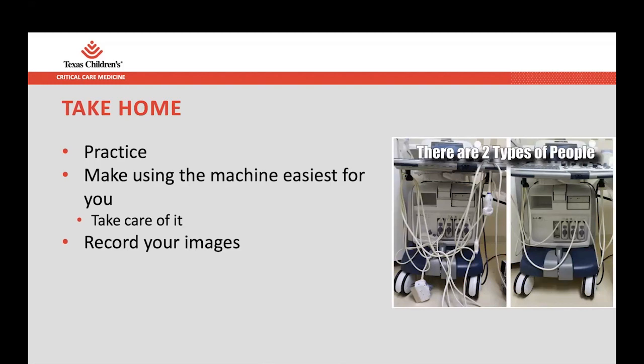And then this whole talk would not have been possible without recording images. And so again, it's just better for everybody. It's better for you. Decisions that you make are well substantiated. Nobody has a full echo done every morning at 7 a.m. And so when we're rounding with the surgeons, we had that available. And then it's better for the patient, of course, in terms of just having a good record for what's going on.